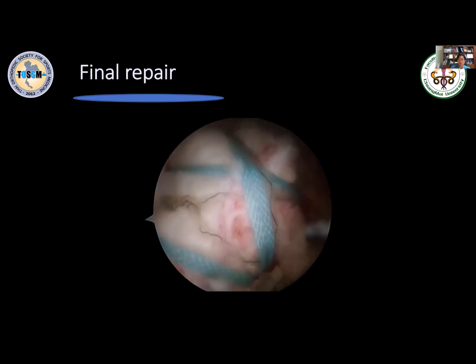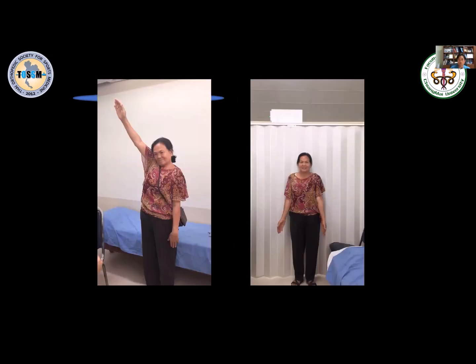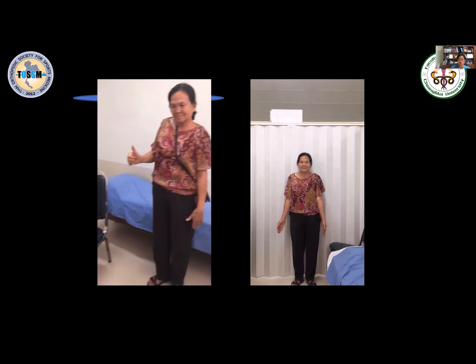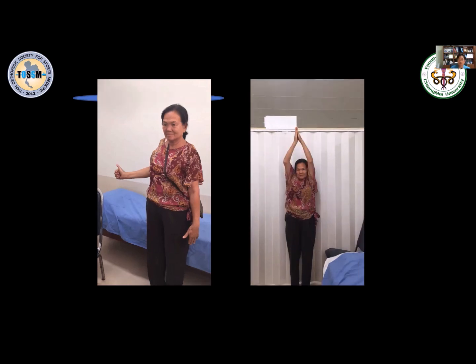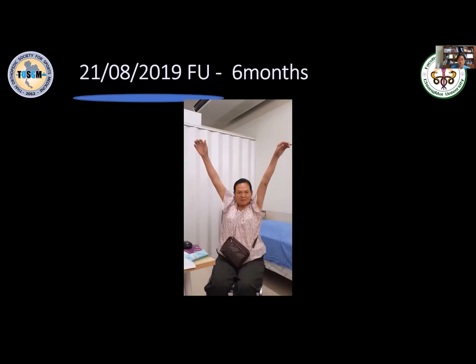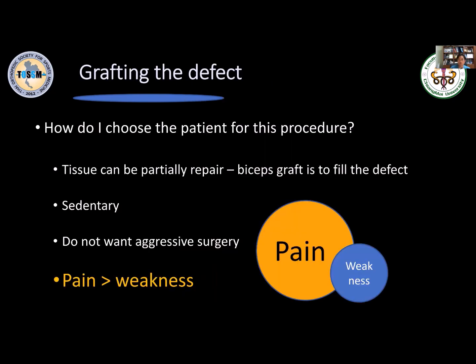And this is her at 3 months. She's satisfied, she is painless. She can move her shoulder up like that. Actually, after the pain has gone, the pseudo paralysis has gone as well. And I had a chance to do the follow-up MRI, and the cuff is intact. And she's quite happy. This is her at 6 months. So I call this procedure grafting the defect with the biceps.